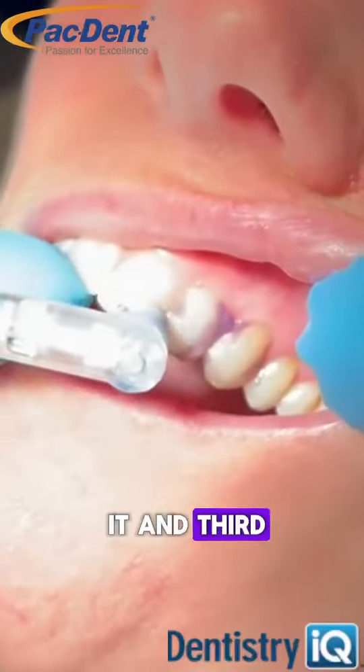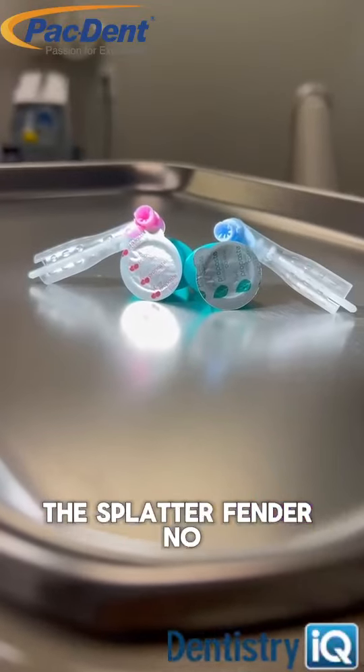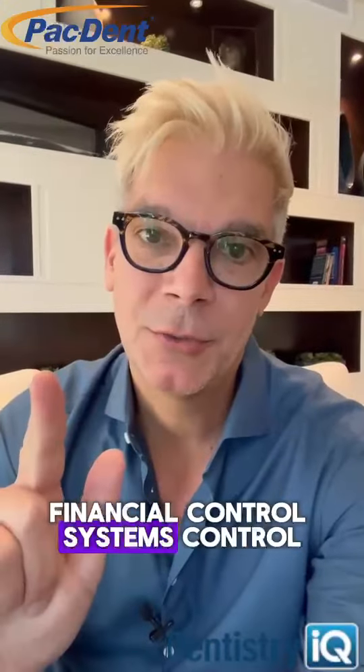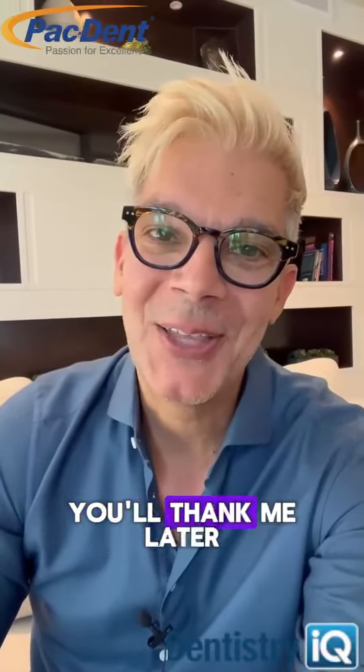And third, what I know my hygienists love the most: the splatter fender. No one wants to wear their patient's prophy paste, blood, or saliva on their scrubs or in their hair. Financial control, systems control, and clinical control — check out PacDent. You'll thank me later.